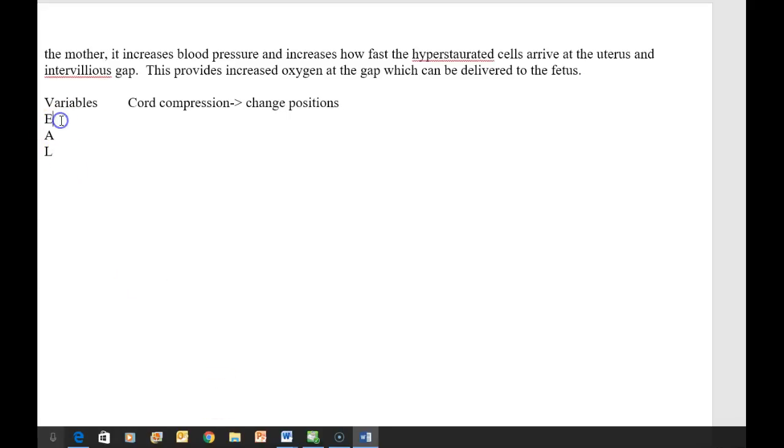Early decelerations are what? That's right, that is head compression. And this is a good thing. This means that we have a baby coming and there are no interventions. A is for accelerations. So here's your CHOP. We have VEAL, V-E-A-L, on that side, and on this other side we have C-H-O-P. So accelerations are okay, meaning the placenta is in good shape.